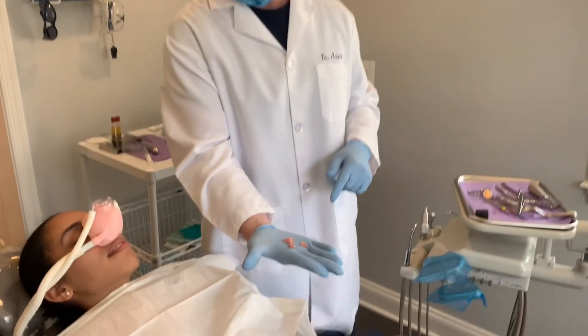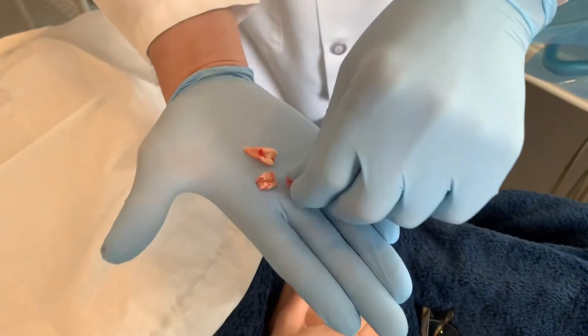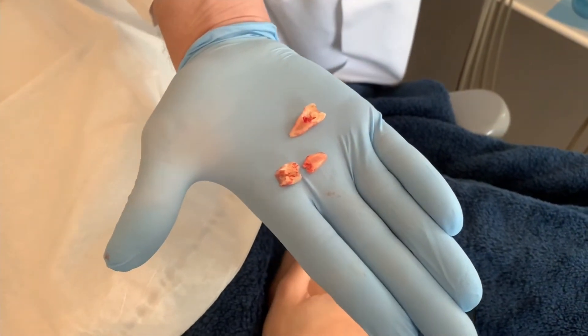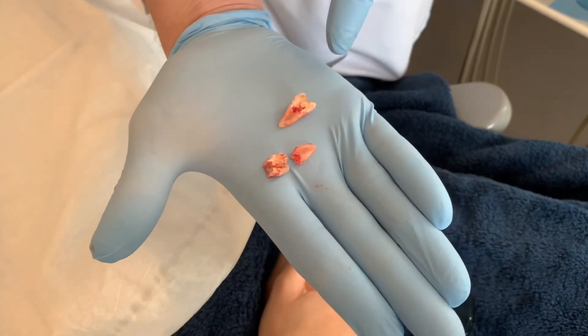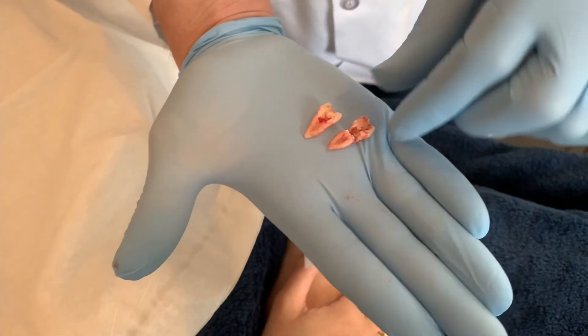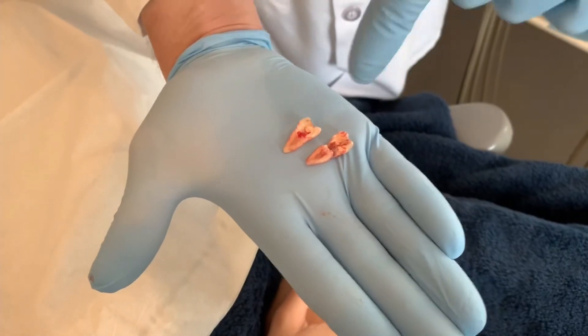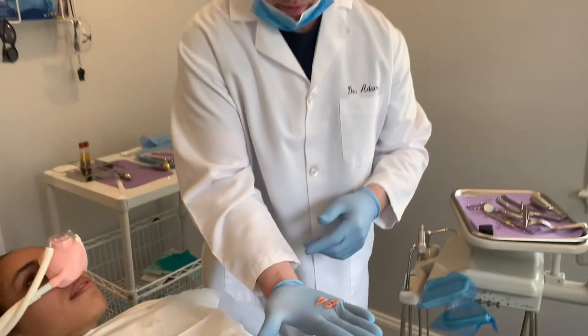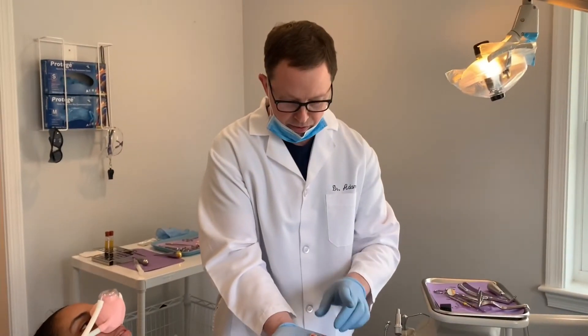At this point, we've actually gotten the tooth out. As you can see, this root came out very cleanly in one piece. We did a really good job of just separating it right down the middle. This is the actual other root, and in the process of extraction, the crown separated from the root. It was pretty smooth — I think it took us maybe three or four minutes to get this tooth out.